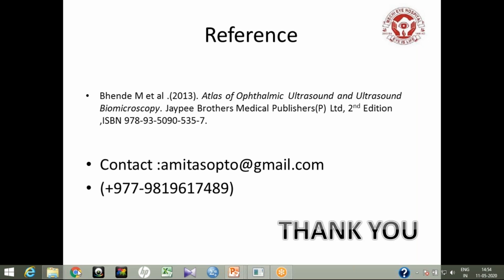Last question. Suppose when I'm doing the 30-degree B scan of the right eye, will the patient look towards the probe with the left eye, or do I have a confusion there? No. When you're doing the axial scan, the patient's eye is closed, but the patient is conscious.